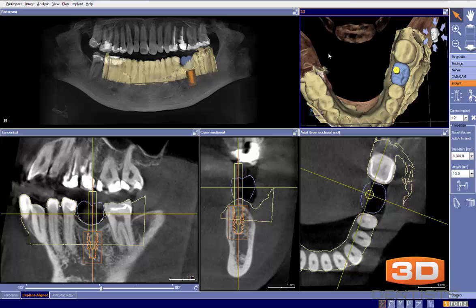This is honestly the typical case that we see in most general practices, and I believe should be in the wheelhouse of most general dentists. More than likely, this case can be done with a punch and can be done quite predictably and efficiently.